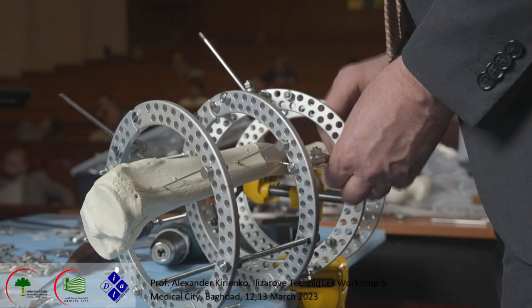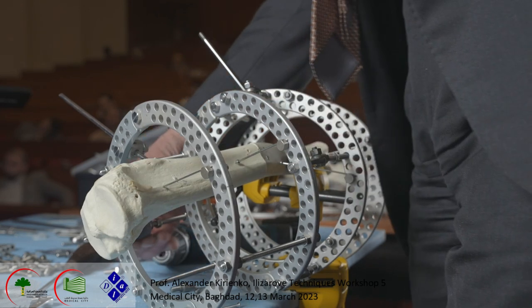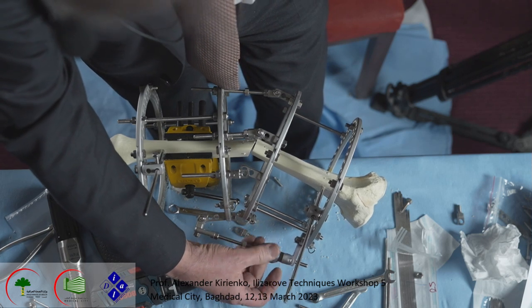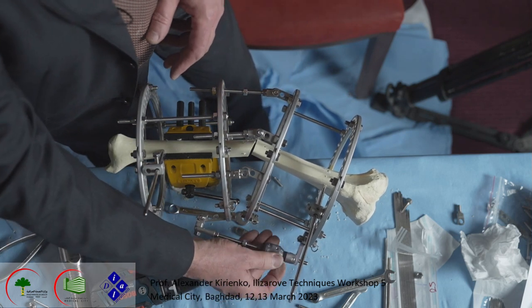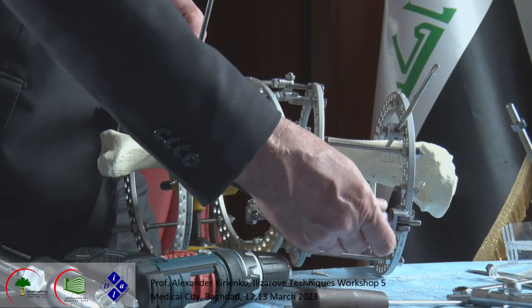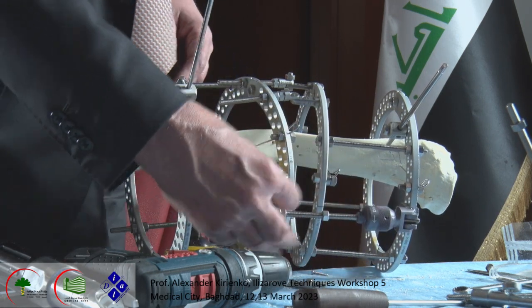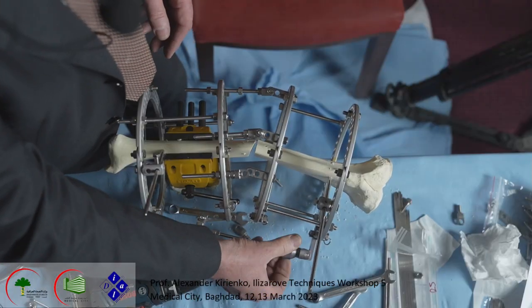Now we do correction. I release this rod, because this rod should go in a shortening. And what we do is slow correction here. We rotate, we lengthen it, okay? Like you see what's happened, these rods became more and more parallel. Okay, we go. It looks slow, but in real life it's fast. Maybe in 3-4 weeks we may do all this correction.